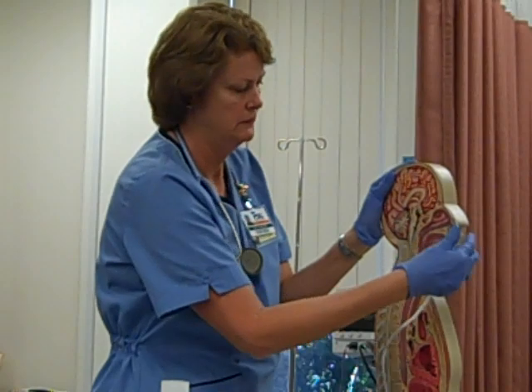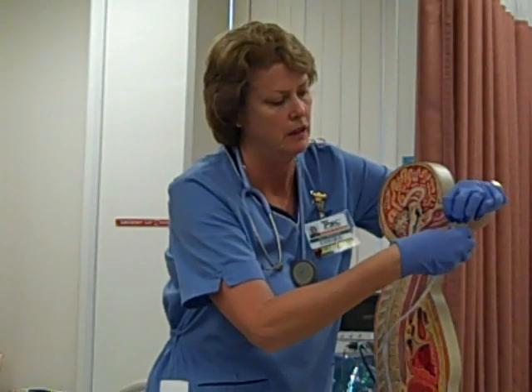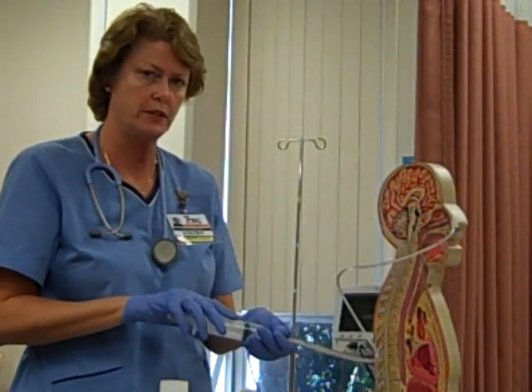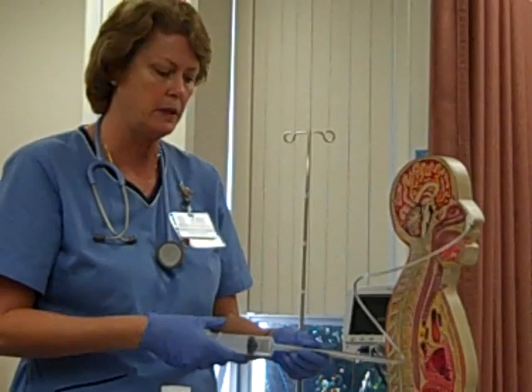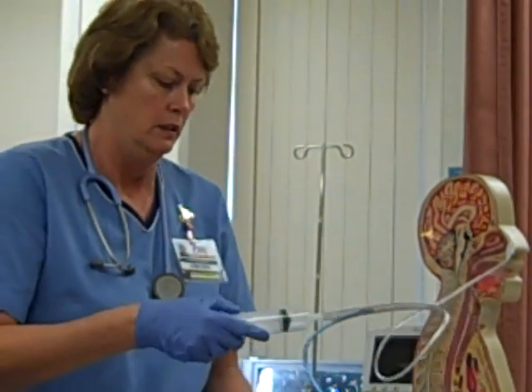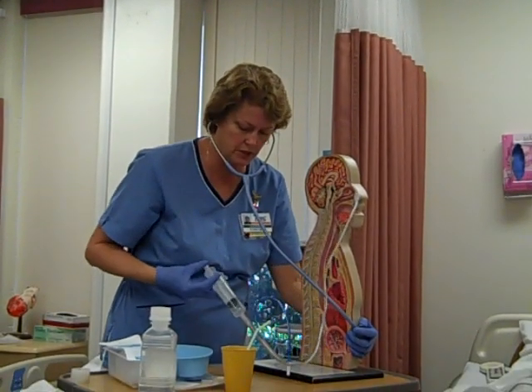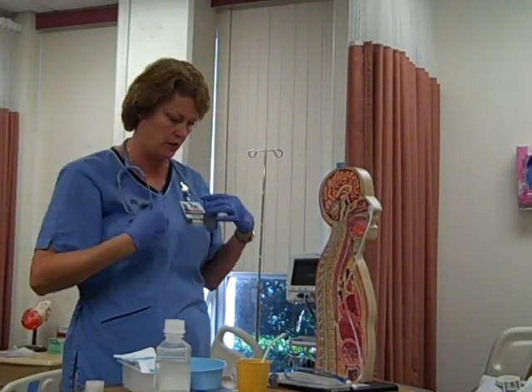So my tube is in where it should be. I can temporarily tape that on the patient's nose. If I had my syringe already hooked up, I can go ahead and aspirate stomach contents — you'll get that really quickly. If I needed to check pH, I would do that now. Then I'm going to do my other check and listen — you should hear a nice big swoosh sound. So I have my two checks: I aspirated, and then I also instilled my air.